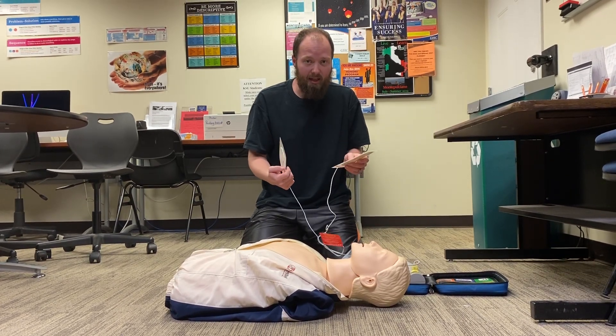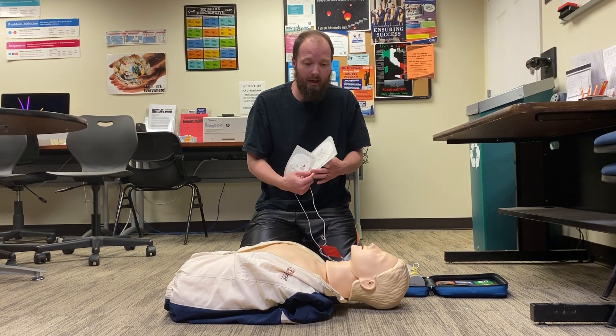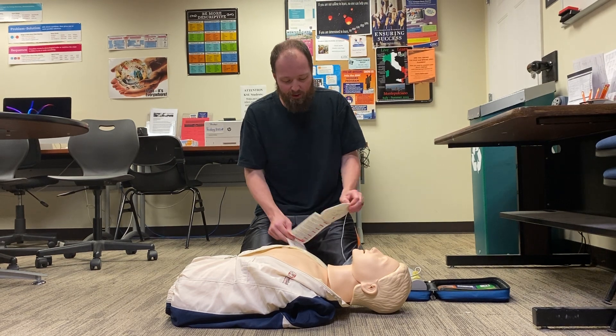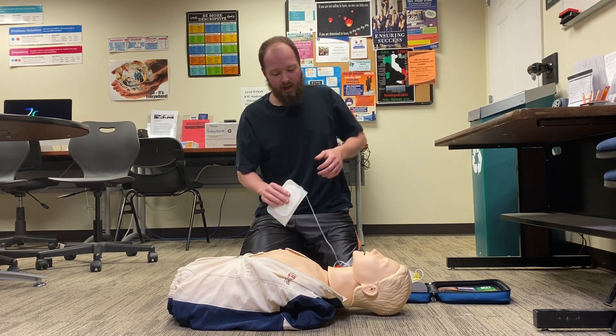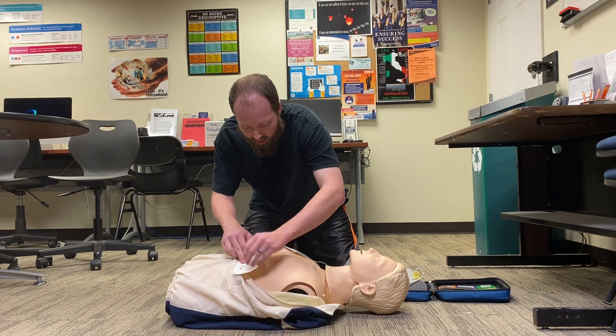Realize that AEDs may have to be put on in a certain way — some AEDs do not. Our particular ones show us where they're located. The first sticker always goes up on the top right portion of the chest, right here. The second one goes down here to complete the electrical current of the heart.